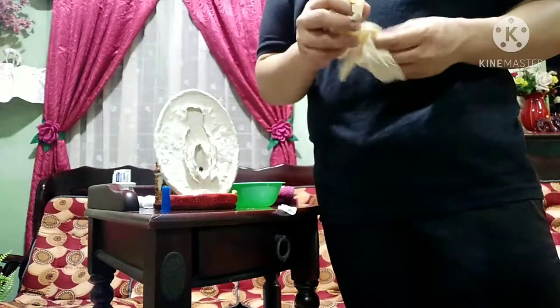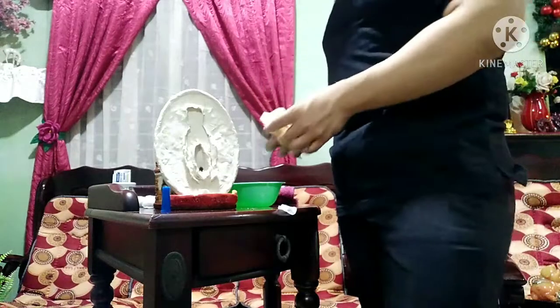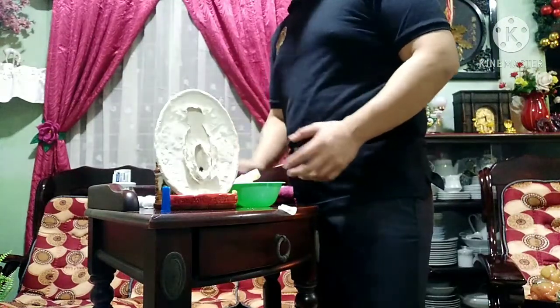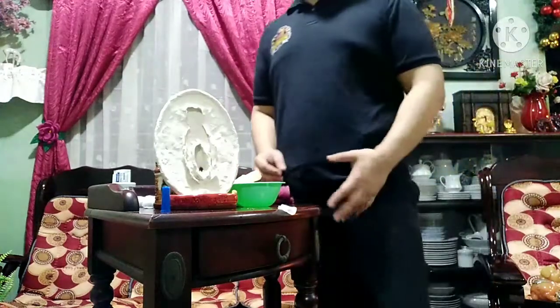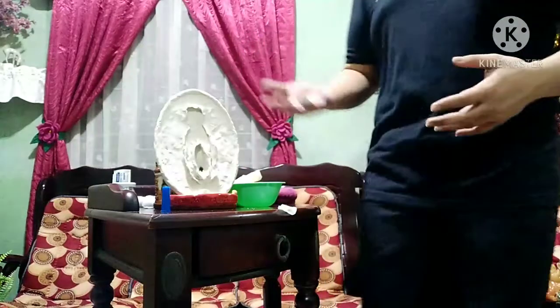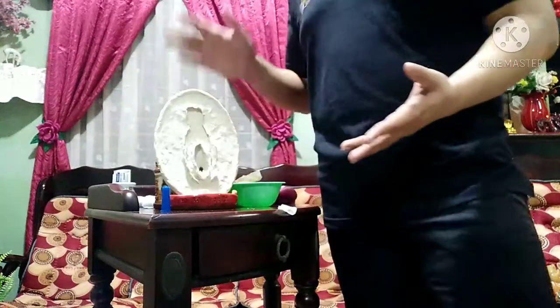Discard disposable supplies and return the reusable supplies and equipment to the appropriate area po. So, yung mga gloves po natin, yung mga naging cotton balls, yung syringe po, itatapon na po natin sila, hindi na po natin sila need. Like yung catheter po, yung urine bag, yung mga ganun po. Yung mga ginamit po natin. And then yung mga magagamit pa po, pwede pa natin siyang magamit ulit.